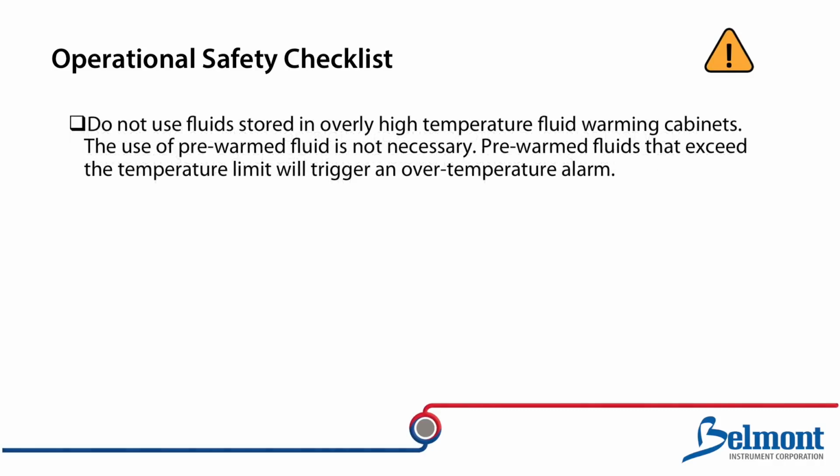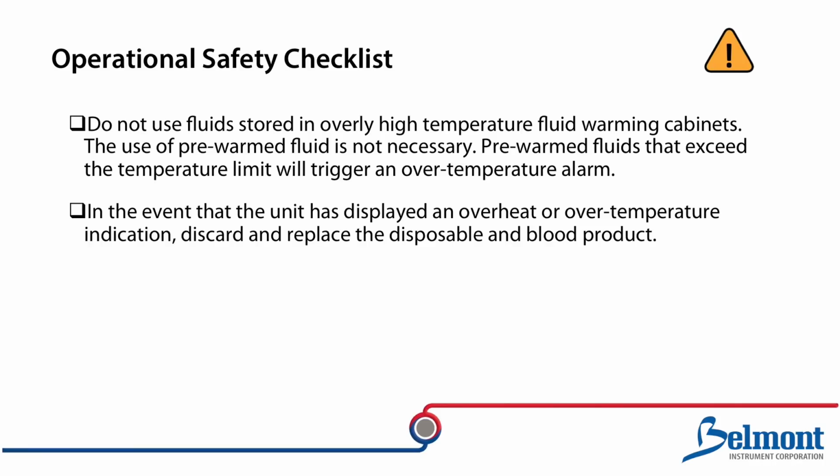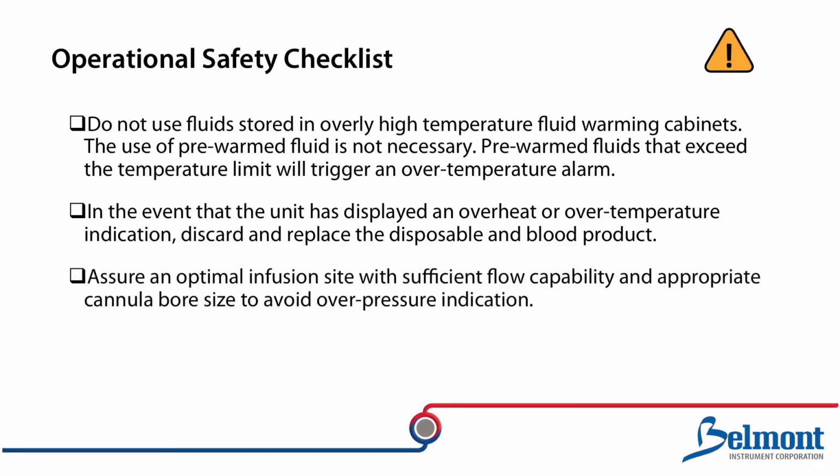Do not use fluids stored in an overly high temperature fluid warming cabinet. The use of pre-warmed fluids is not necessary. Pre-warmed fluids that exceed the temperature limit will trigger an over-temperature alarm. In the event that the unit has displayed an overheat or over-temperature indication, discard and replace the disposable and blood product. Assure an optimal infusion site with sufficient flow capability and appropriate cannula bore size to avoid overpressure indication. Assure that bags have fluid in them.